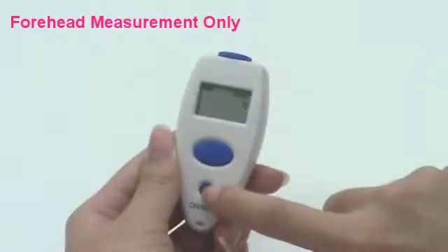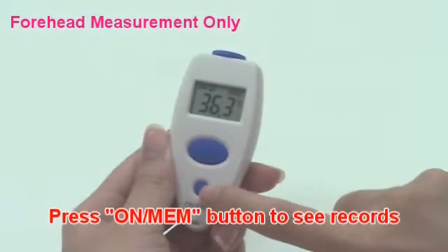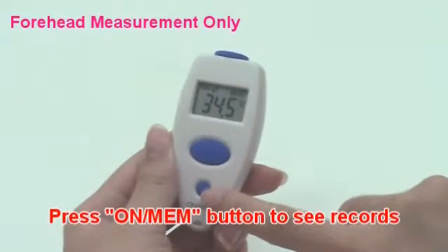If the temperature is within the normal range, the thermometer records the last measurement data before powering off. Press the memory button to see the temperature records.